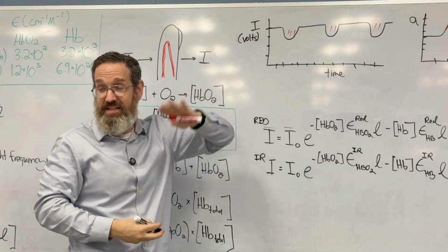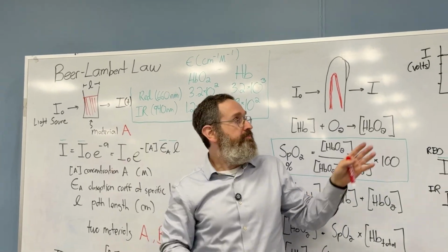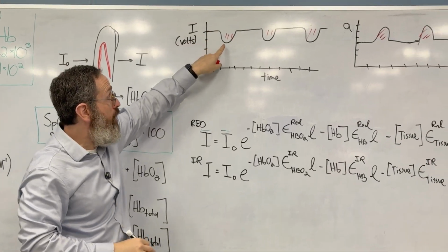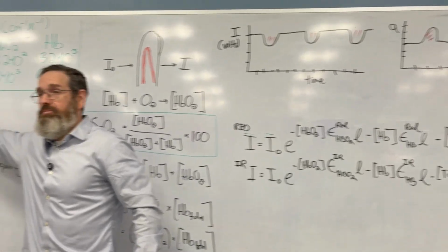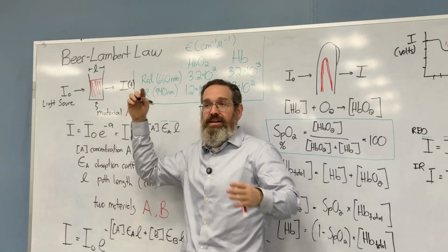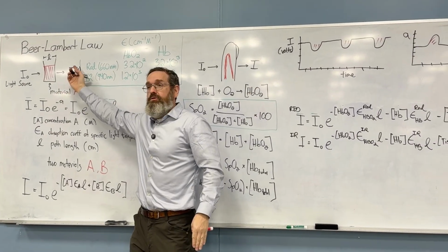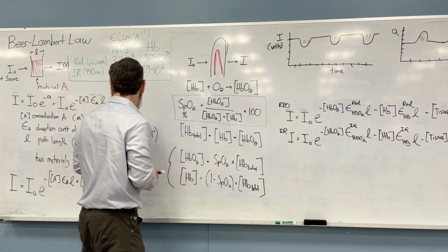Remember, the sensor converts the light to a voltage. So just think of this as a voltage. And the voltage is dropping every time the heart beats because there's less light coming in. If the light dropped all the way to 0, I would have 0 voltage. That makes sense? So we have this voltage sitting here.